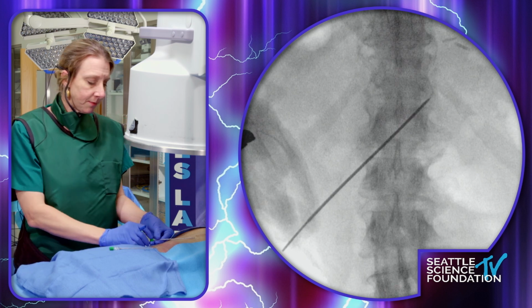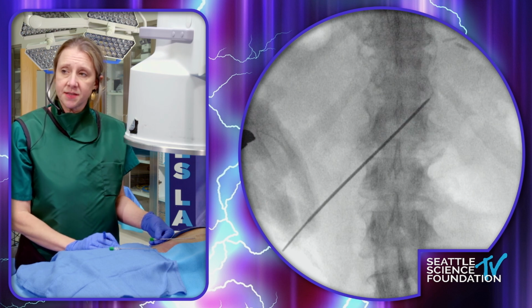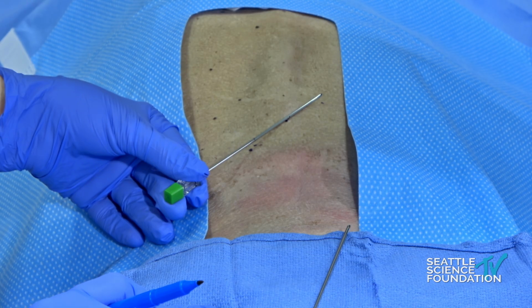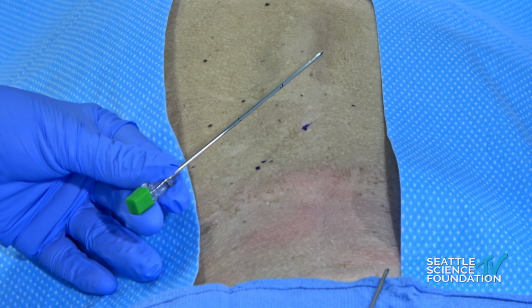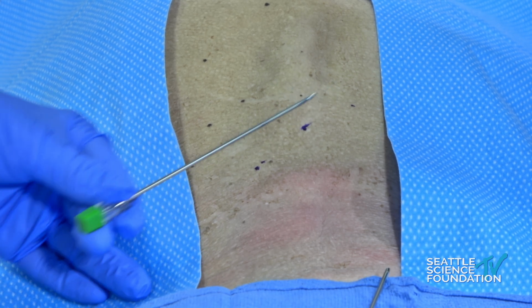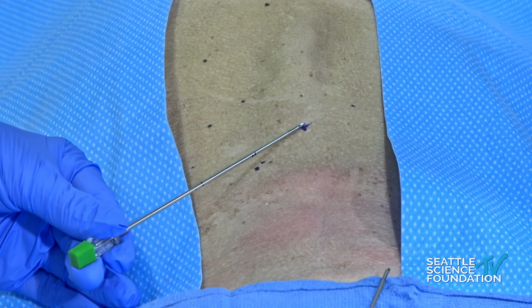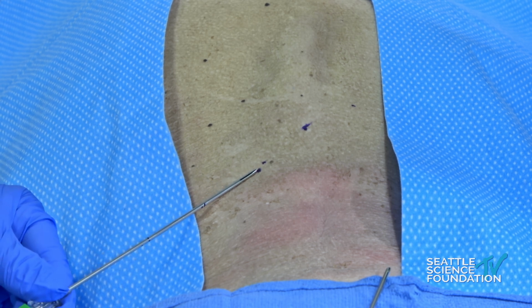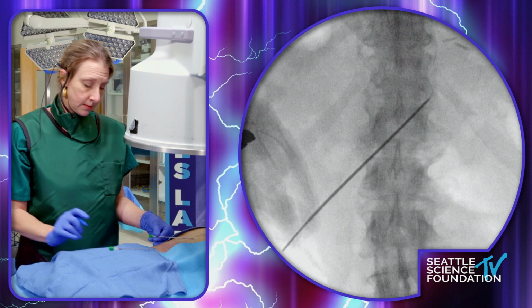So what you see is I'm laying my needle on the skin. The first step to the procedure is trajectory planning. I have the tip of the needle on the skin with a marking that is just beneath the T12 pedicle. The second marking here is my location where I hope to enter into the epidural space and the intervertebral foramen. And then this will be where I plan to puncture the skin. So if you go back to the x-ray, this is what you see here.